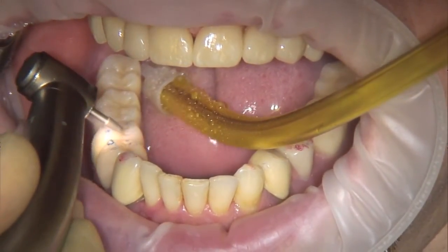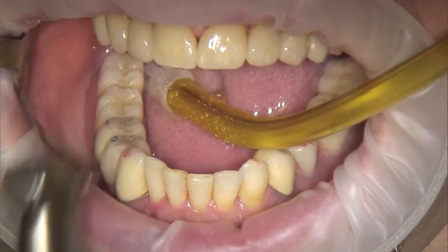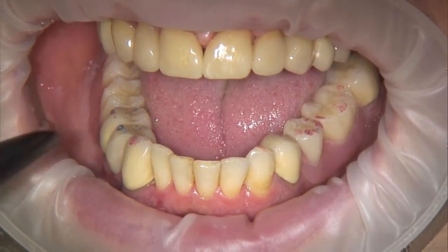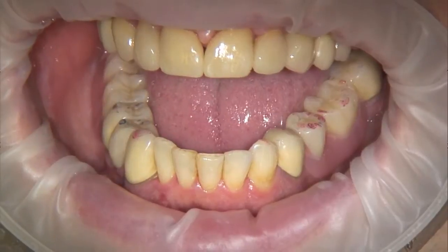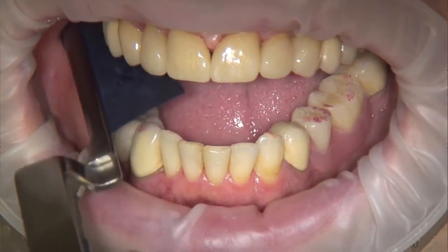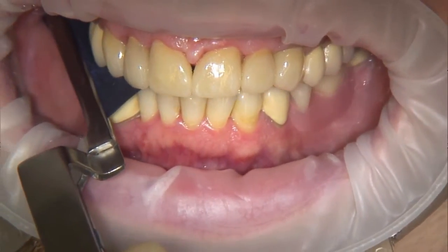High spots can be detected easily as dark marks and normal contacts as light marks. Because of the pressure-sensitive articulating paper, the dentist is able to carry out precise marking. Especially with the principle of bilateral balanced occlusion, optimal stress distribution can be achieved with this method.